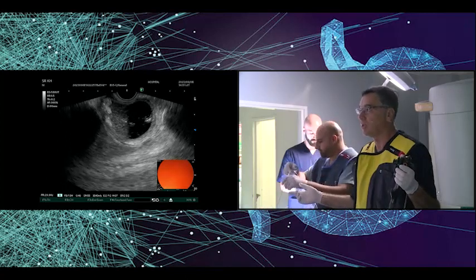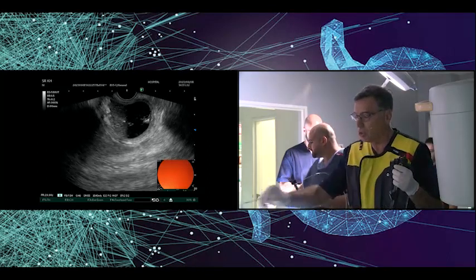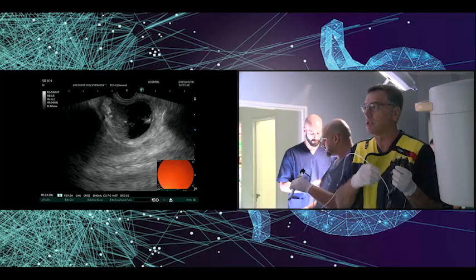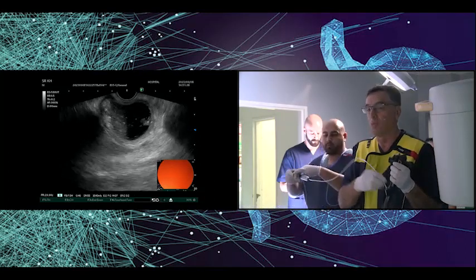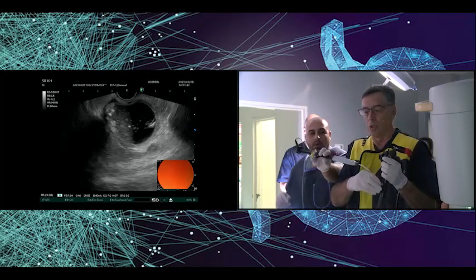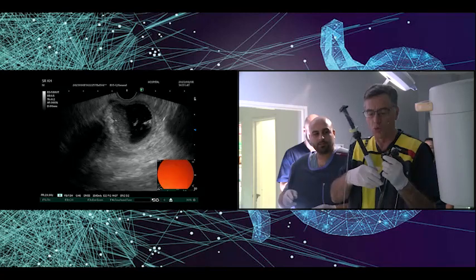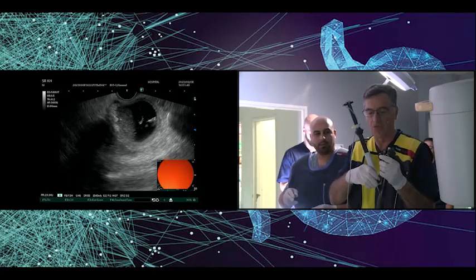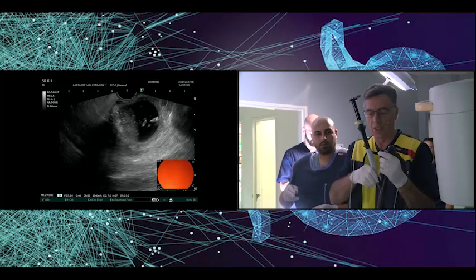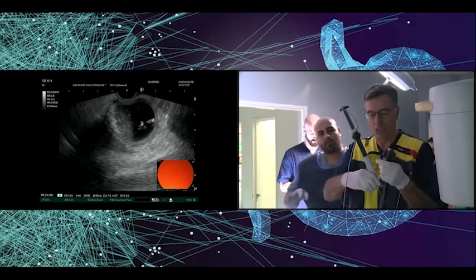We tried to discuss between doing transpapillary gallbladder drainage, or a percutaneous approach, or EUS-guided gallbladder drainage. And finally, we decided to do the gallbladder drainage because he is very old, and we have to have a final solution with the least risk possible.